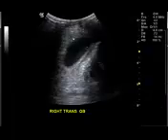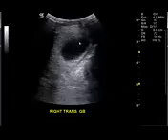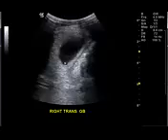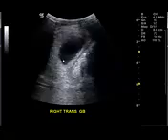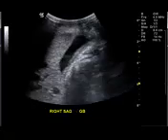Okay. One of the benefits of imaging the gallbladder with ultrasound is that there are no gas-containing viscera anterior to it, so the gallbladder is always very well seen. And what you need to know is what's artifactual projecting into the gallbladder, because it's anechoic. You can have reverberations and you can have problems with side lobes and slice thickness artifacts. So these are linear areas that project in the lumen. But you got to be careful because some of them project from the outside in.